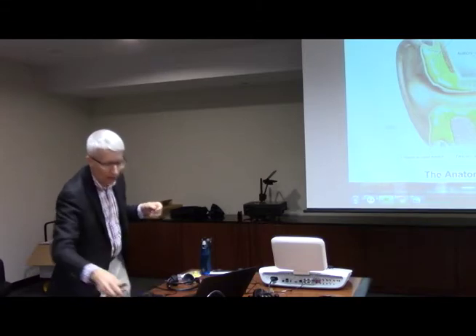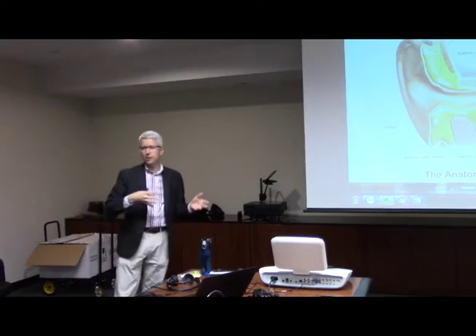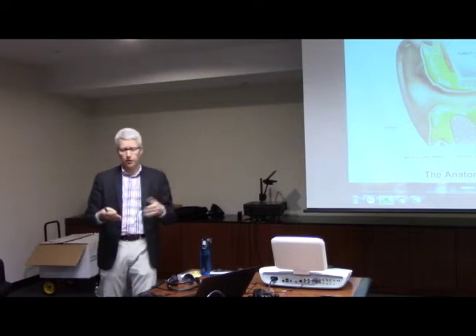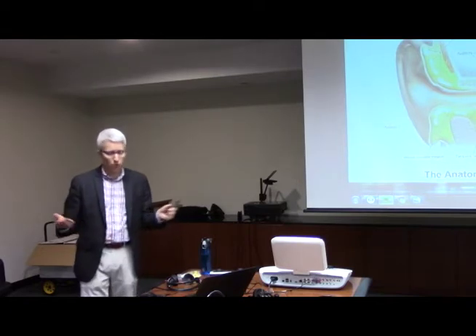I won't go into all the details, but there are some differences in why you use one versus the other. Some of it's personal preference, sometimes it's ear anatomy, sometimes it's mandated which one you use. But both are available with most audiometers, and people will use whichever one they need.